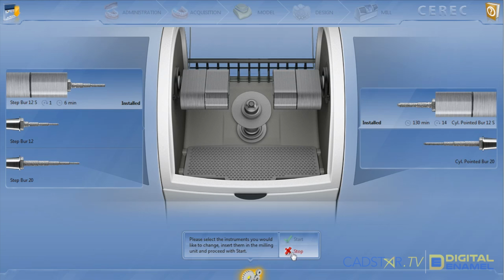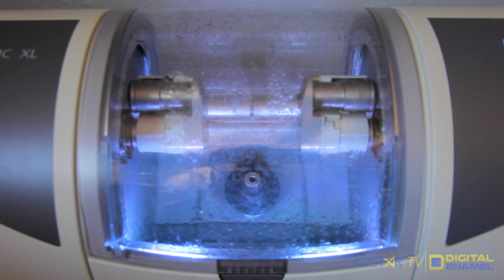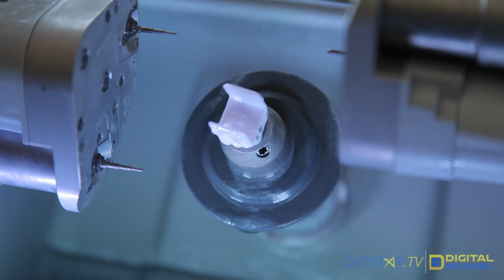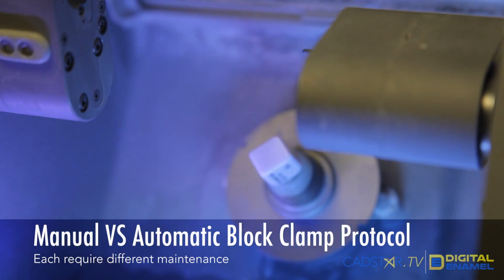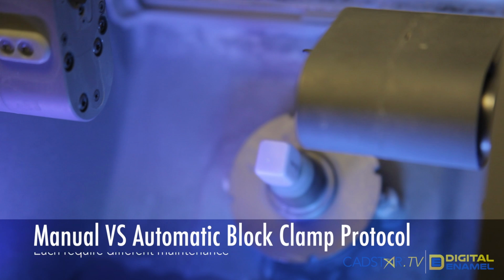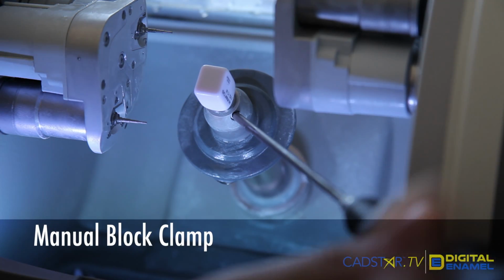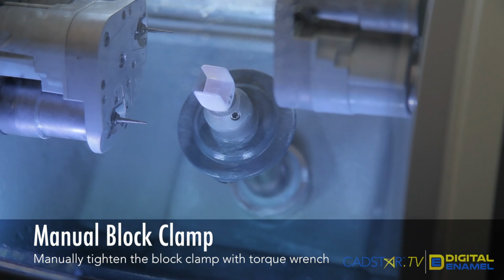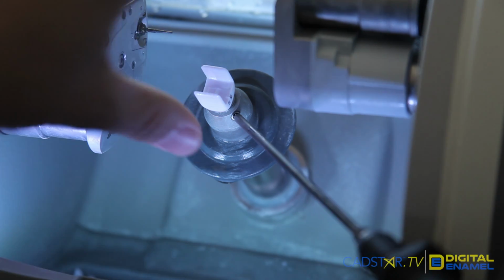Back at the instrument screen, you'll just hit stop. This will get you out of it and get your motors back to the proper position. There's a difference in maintenance protocol for the manual block clamp and the automatic block clamp. For the manual block clamp, you'll actually have a torque wrench and a set screw so that you can place the block in and tighten it, and when you're done, loosen it, and then you can remove the block.